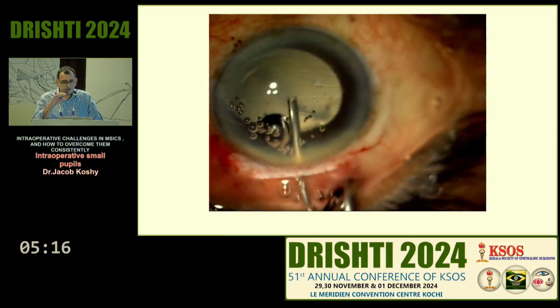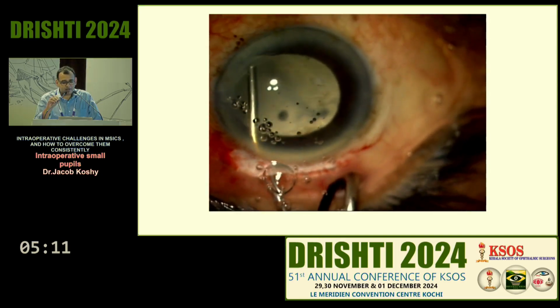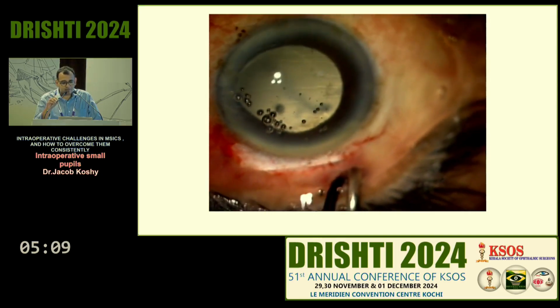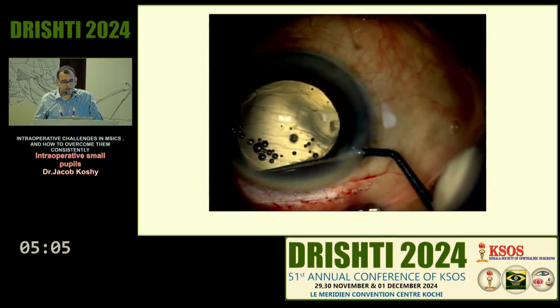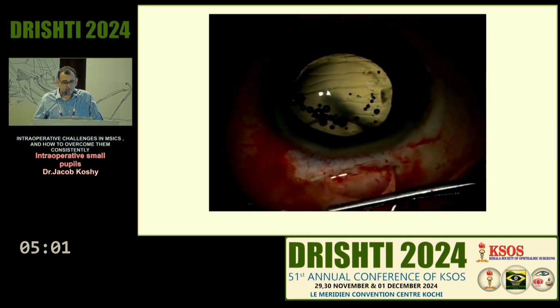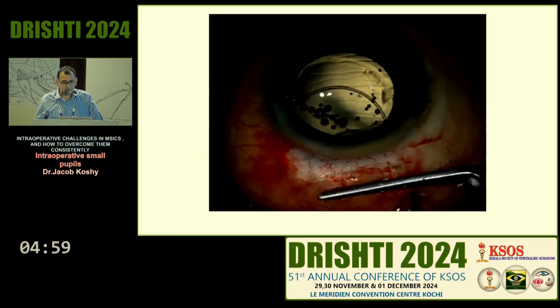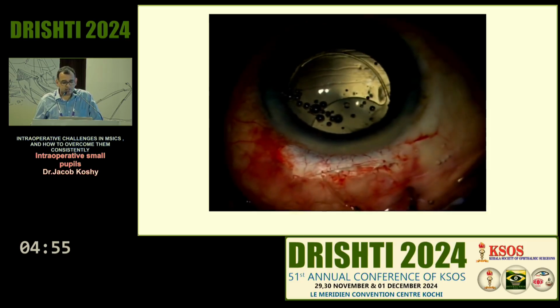Now, once you have done an adequate vitrectomy and you've cleaned up adequately, now here you're definitely planning to put the lens in the sulcus. Remember to inject the viscoelastic under the iris and above the anterior capsule. And again, just check all around if there is adequate support. Obviously, a PMMA lens would be better here, or a 3-piece lens. Don't put a single-piece foldable lens.